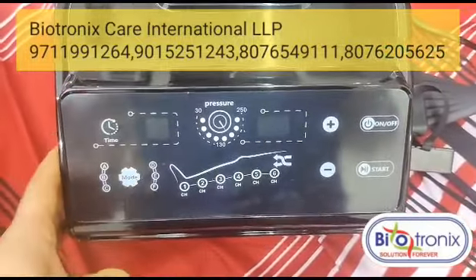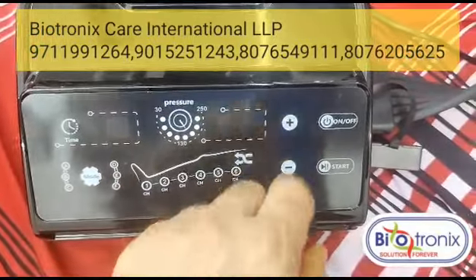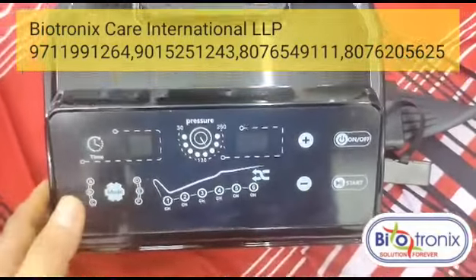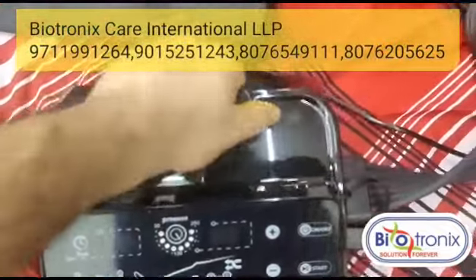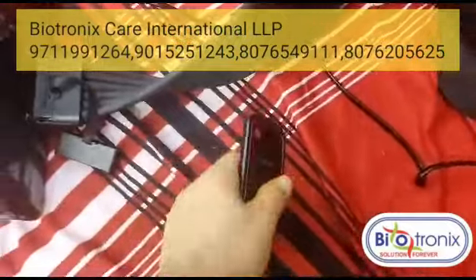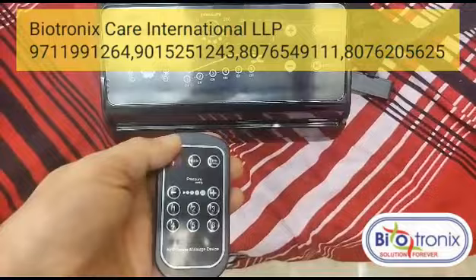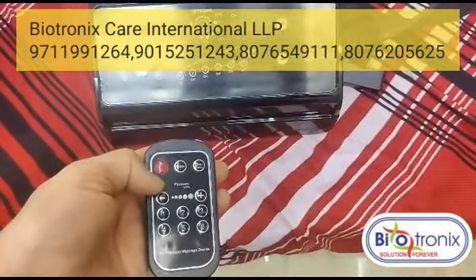You can adjust the timer from 10 to 60 minutes, and the pressure range is from 30 to 250 — you can increase or decrease it from the same controls. There is also a handle to carry the machine, and a remote control, so you can operate the machine with either the touchscreen or the remote.